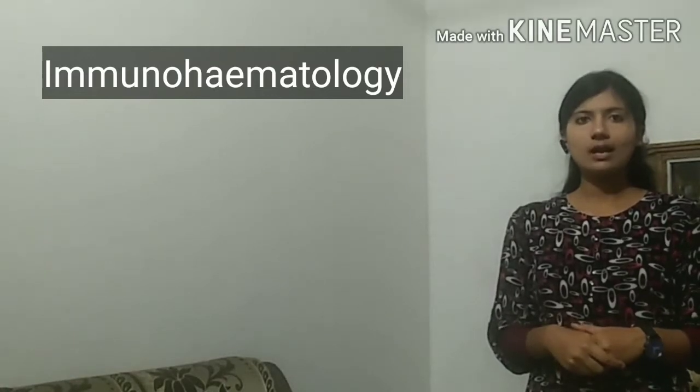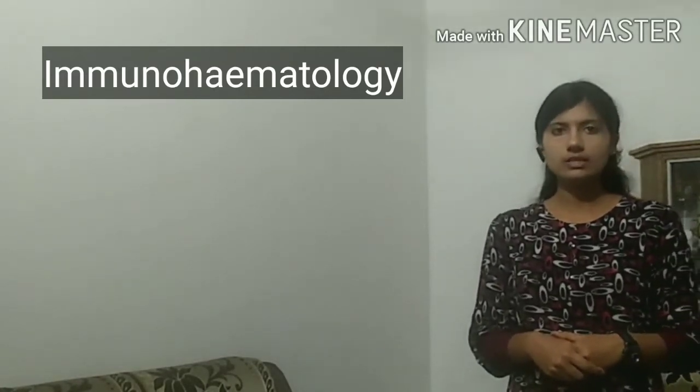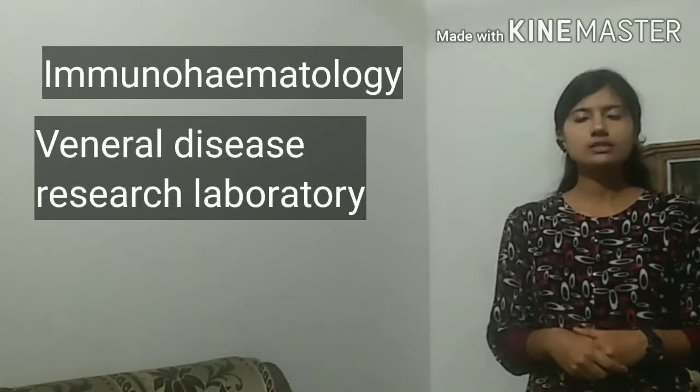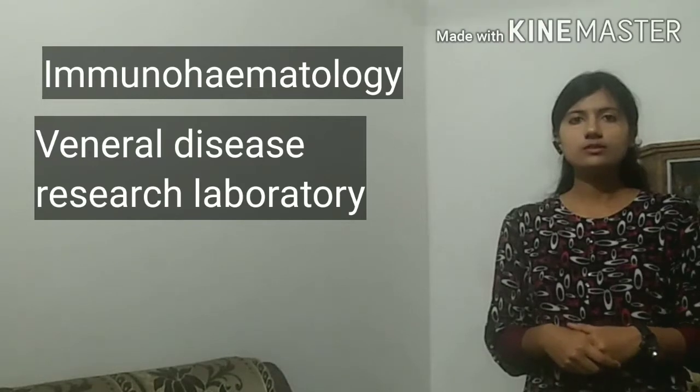Next, immunohaematology. It is a study of RBC antigen antibodies associated with blood transfusions. Next, venereal disease research laboratory test. It is a blood test mainly used for syphilis.